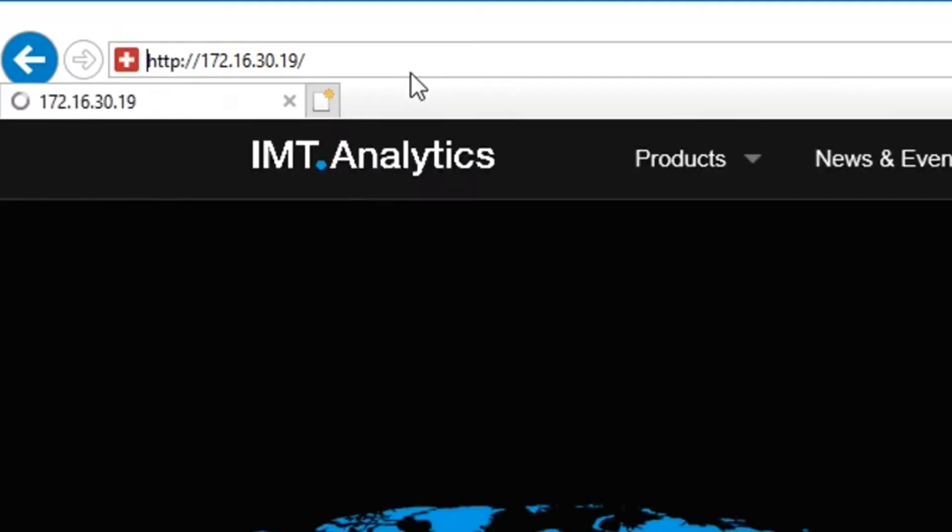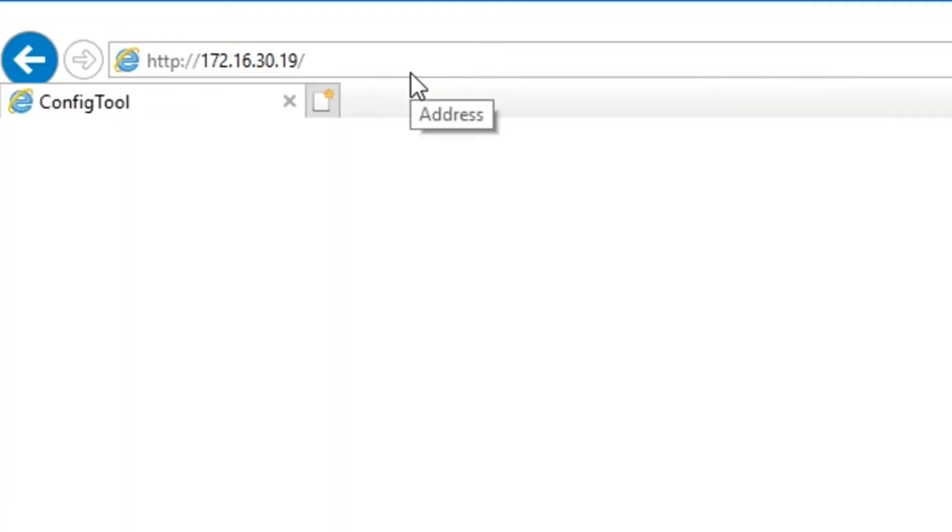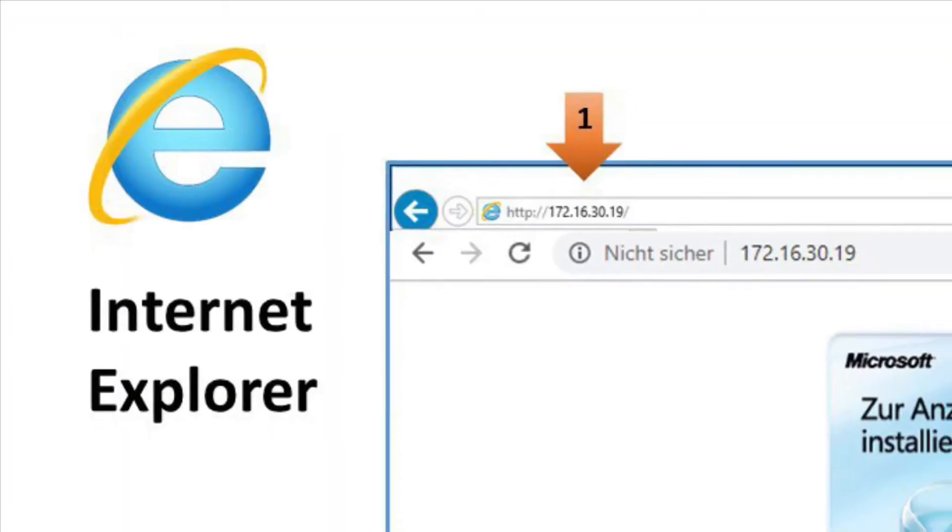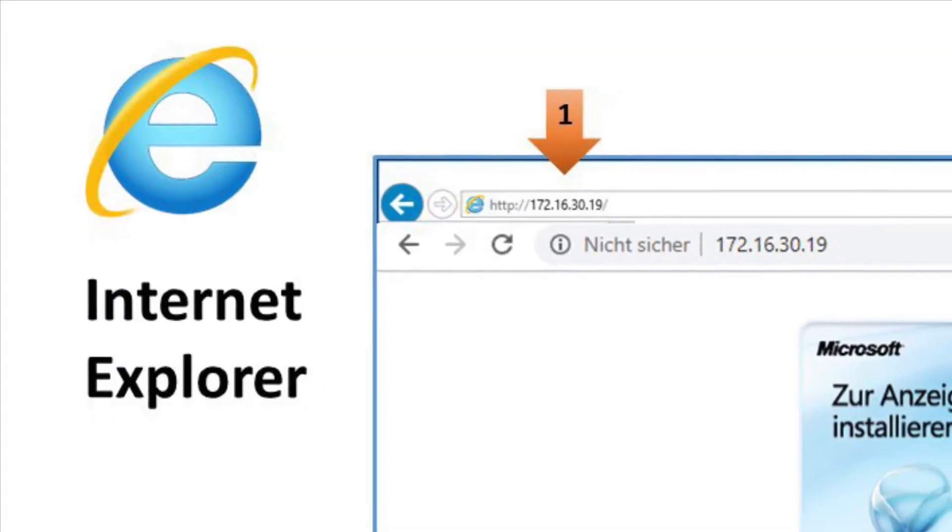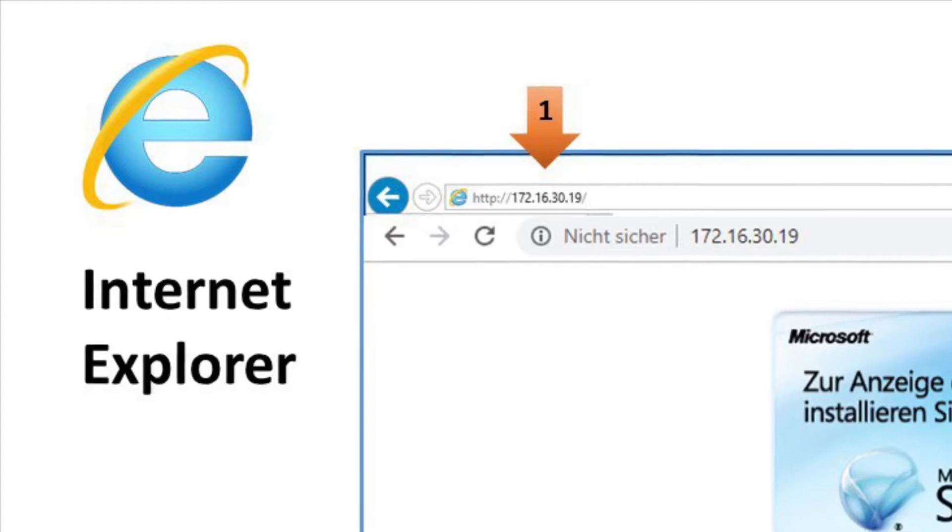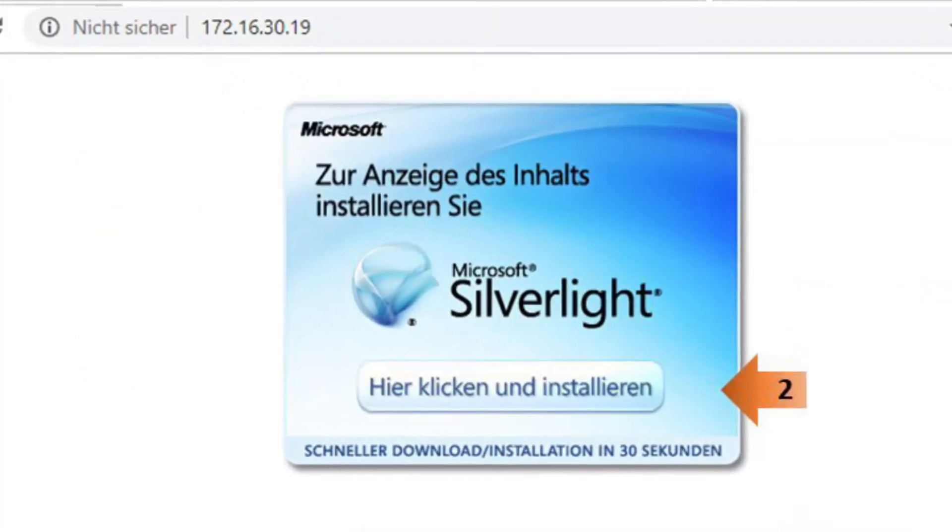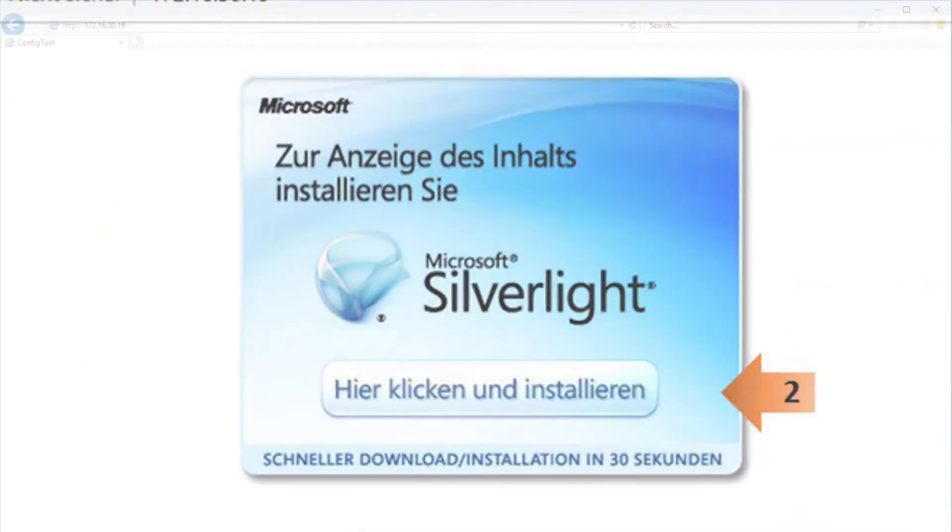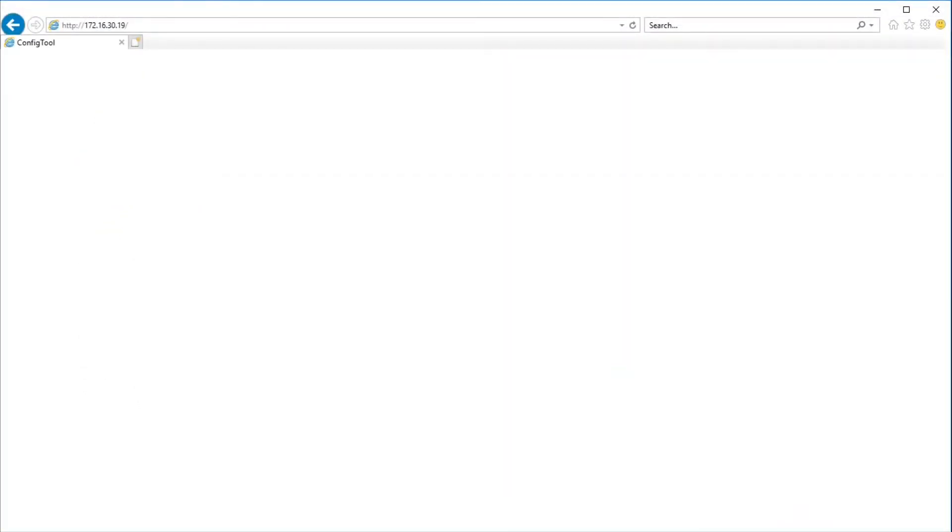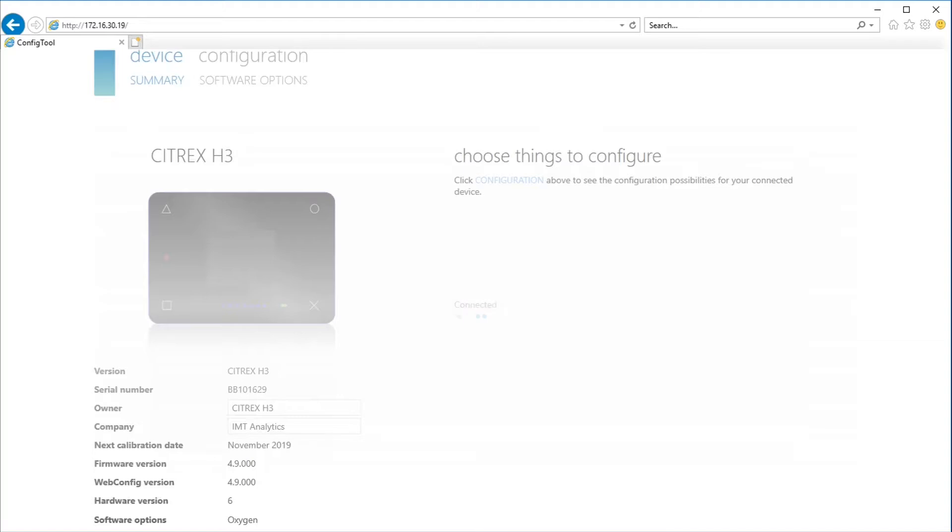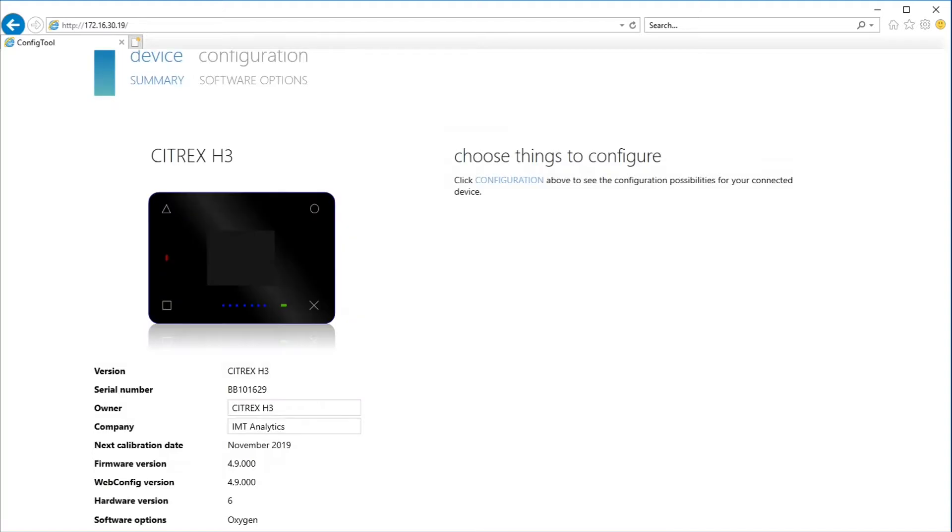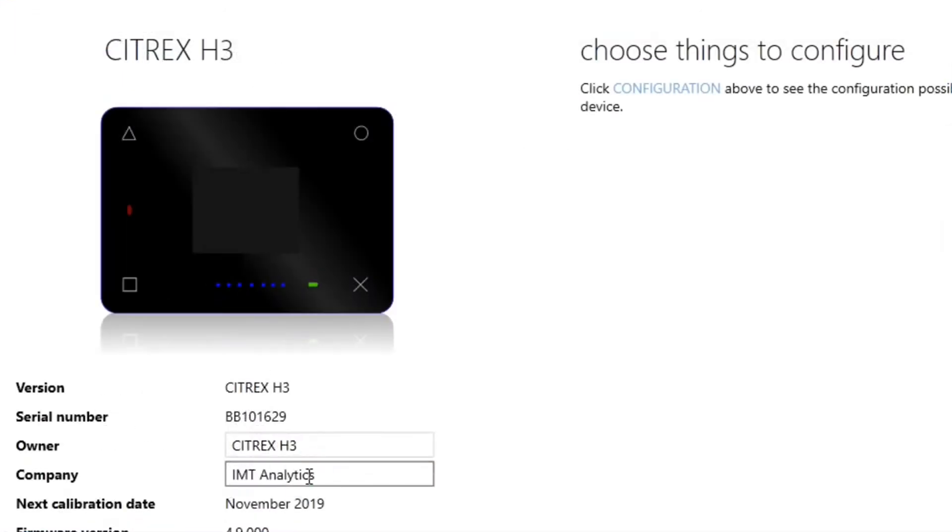It's important that you use Internet Explorer. Then you have to install first the Silverlight software package. After doing that, you can connect to your CITREX device via browser. This is very cool.